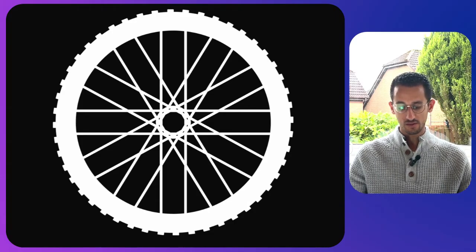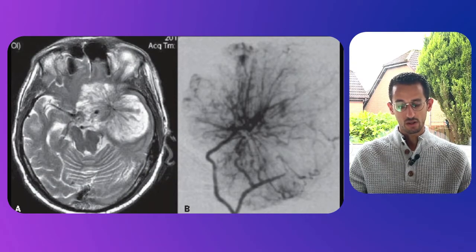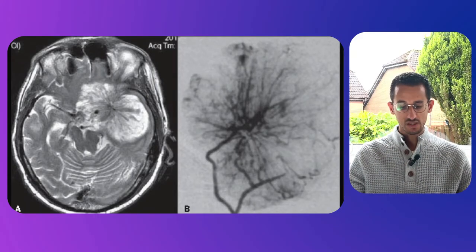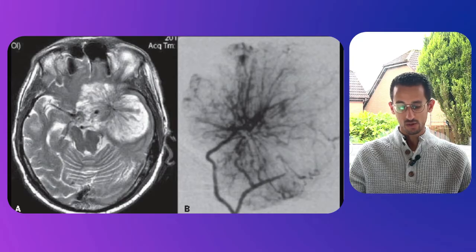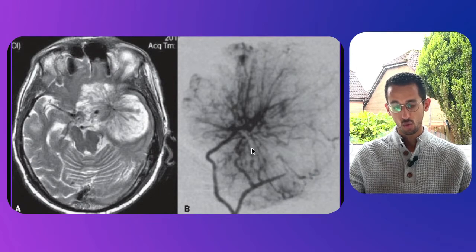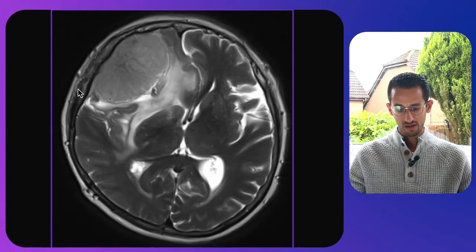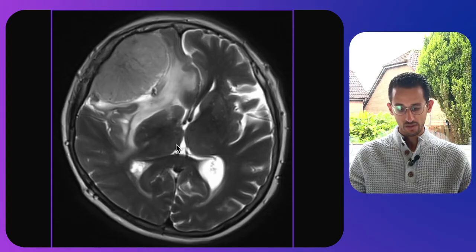Moving to the next one — this is a spoke wheel sign. On the MRI scan on the left, there is a large lesion with spoke wheel appearances, which is characteristic for meningiomas. On the right, the angiogram shows the blush or increased supply into the meningioma. Here you can see a similar spoke wheel appearance in another meningioma — extra-axial with this spoke-like pattern within it.